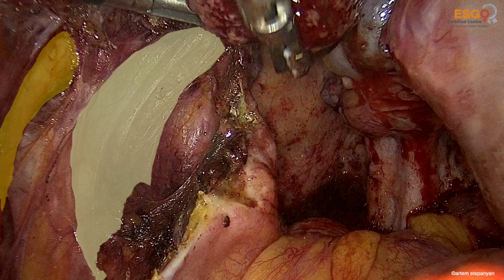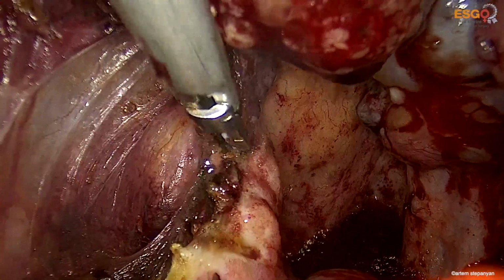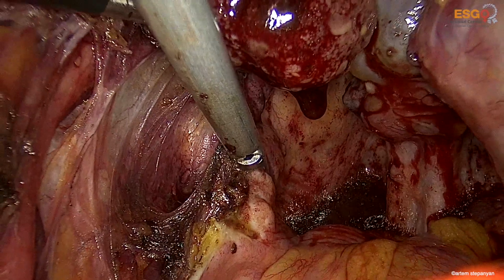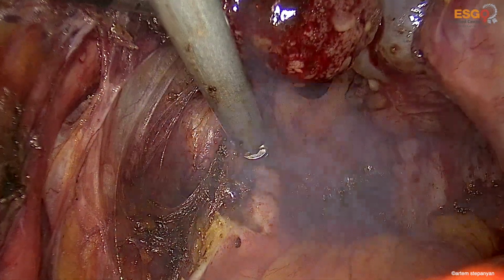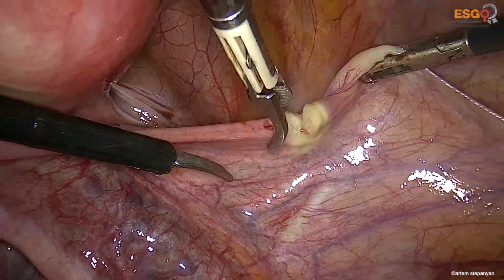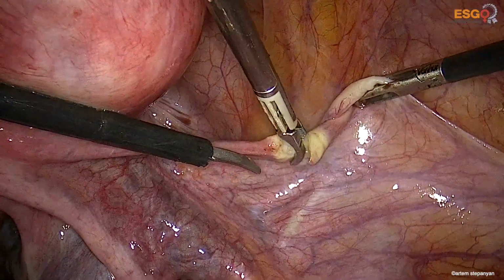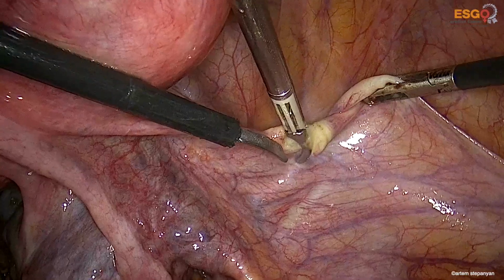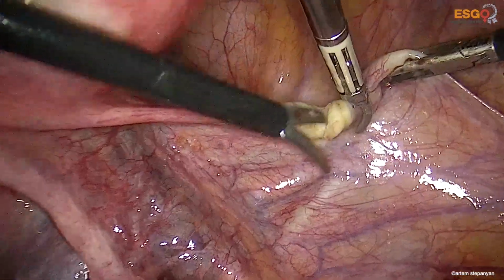And here the ureter and the inferior hypogastric plexus are highlighted. We obtained visual control over those structures, thus avoiding bladder dysfunction or ureteral damage in the postoperative period.